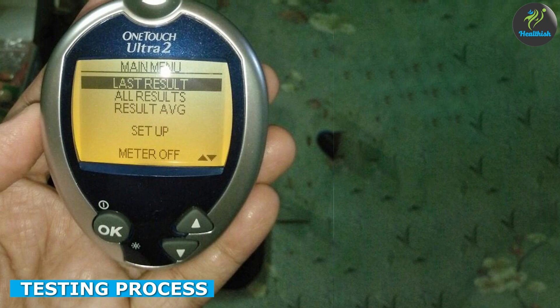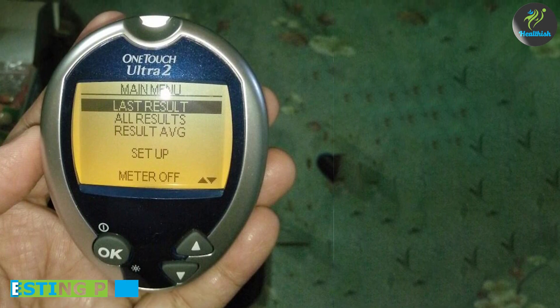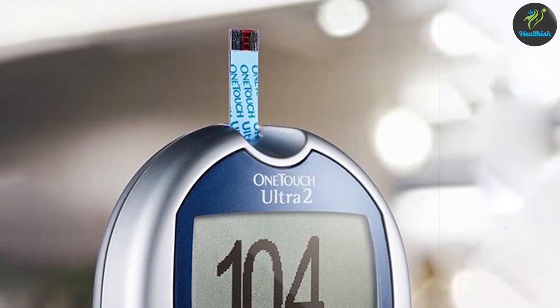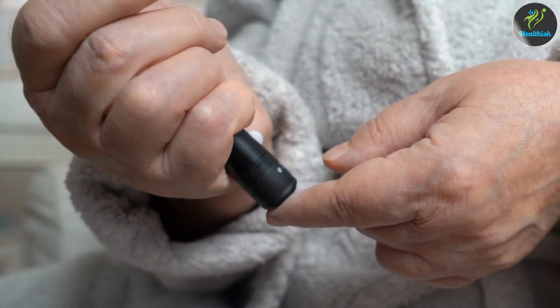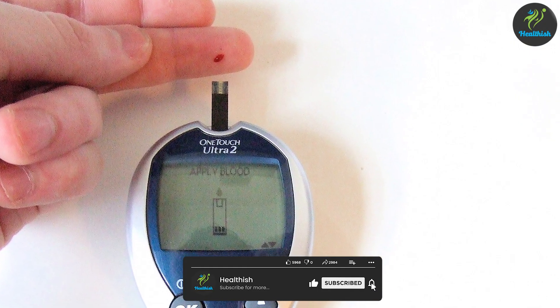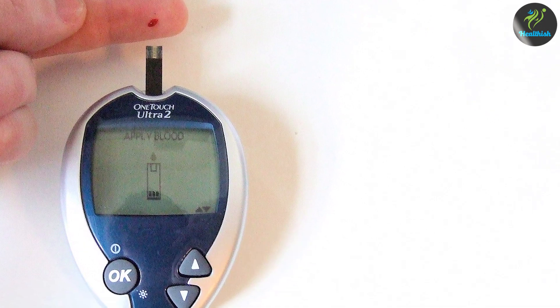Let's talk about the testing process with the OneTouch Ultra 2. To begin, insert a test strip into the meter and wait for the device to turn on. Once ready, prick your finger using the provided lancing device and apply a small drop of blood to the test strip. The meter will then analyze the blood sample and display your blood glucose reading on the screen. It's important to follow the manufacturer's instructions for accurate results.